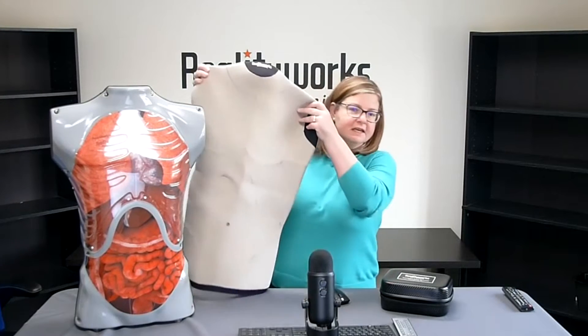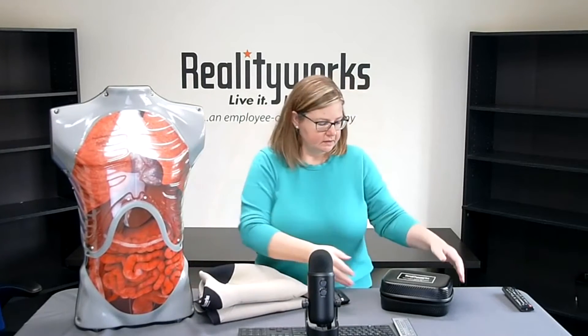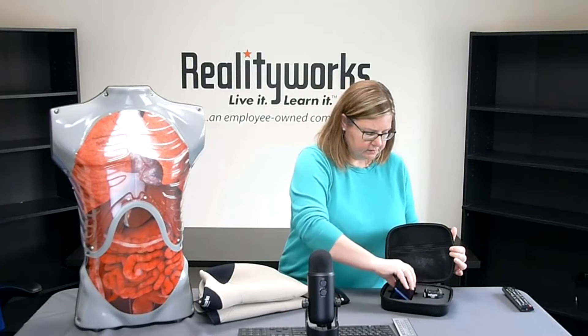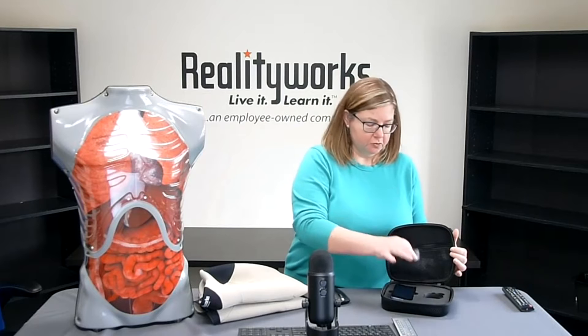The auscultation trainer comes with the following components: the auscultation trainer torso, a skin overlay, a smart device with a preloaded app, a reality scope, and a storage case for everything. It also comes with a one-year limited warranty and an online curriculum.